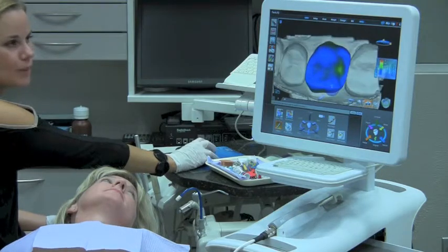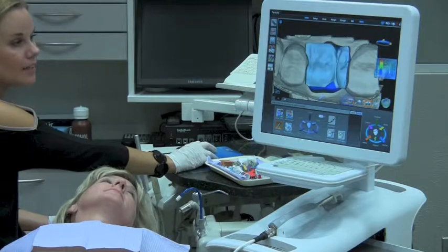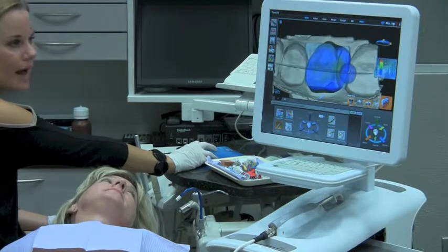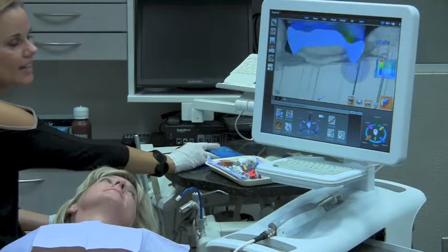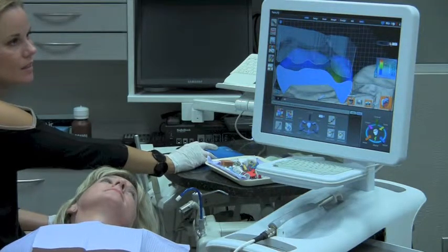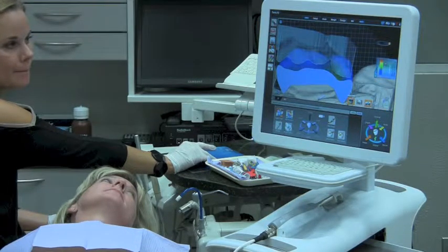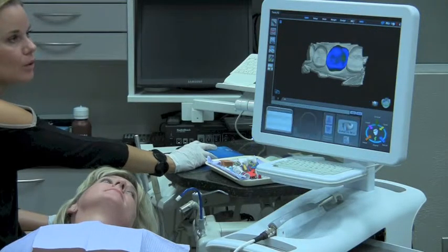But on the occlusal aspect, I know that the opposing tooth has to come into play. So I'm going to take a look at my opposing in relation to the thin spot by slicing. We have an X axis, a Y axis, and a Z axis, and I can slice into that thin area. I have the ability to see how much room I have to make changes — and I can see I have plenty of room here to thicken this area up. Now I'm happy with my thickness, so now we're ready to go to the mill tab.